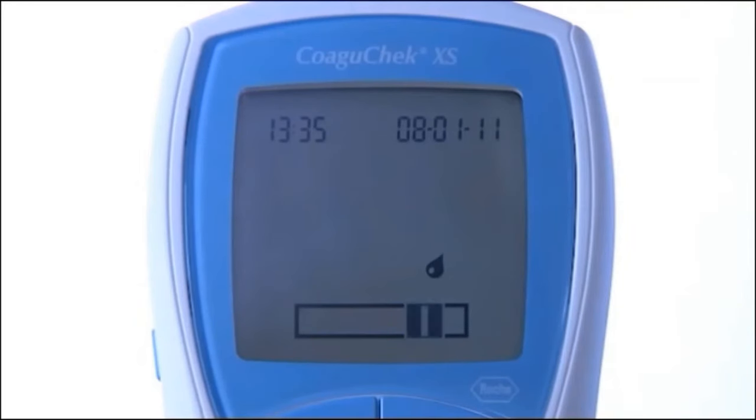At this point, the testing begins. The meter performs an automatic quality control check on the test strip and QC appears on the display. Following a successful outcome of the quality control check, a tick appears after QC and the coagulation measurement begins. The hourglass flashes until the result is displayed. It is automatically saved to memory.